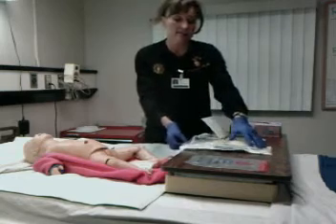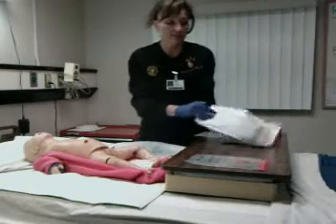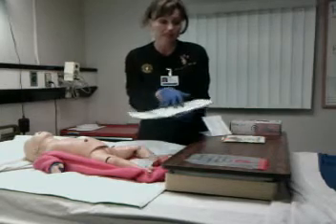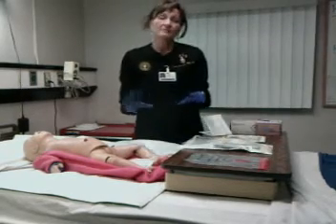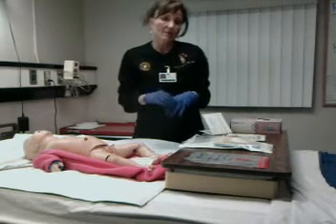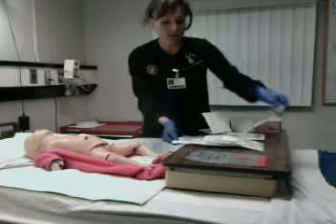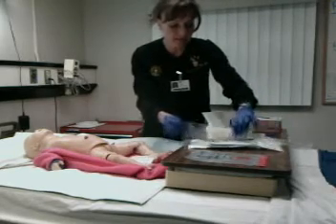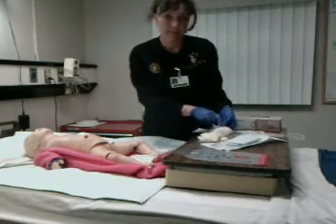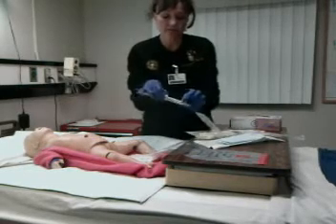You'll also gather a set of sterile gloves that you will need, even though your kit may or may not have a set of sterile gloves. Remember that it depends on the place that you work. Some places may have a kit — Sanford, for example, has a pediatric cath kit and it actually tells you what size is needed. This one says it's an 8 French, and there is a sliding scale that you can use depending on the size of your baby. The kilogram rate of your baby will tell you what size to use. If an 8 French is too small and they don't have anything else, feeding tubes can also be utilized or NGs.